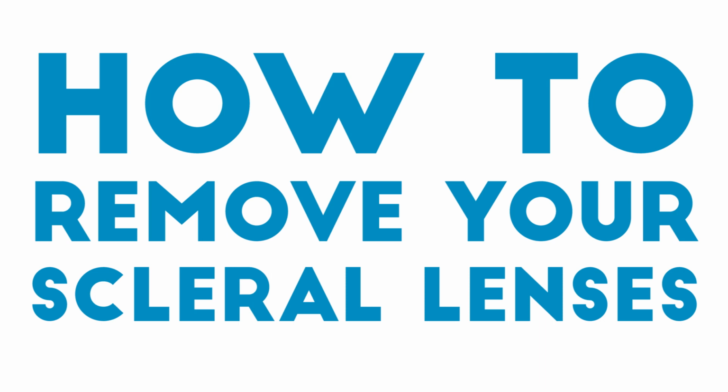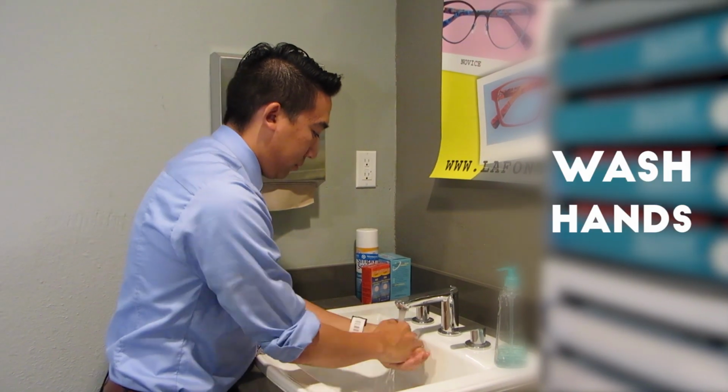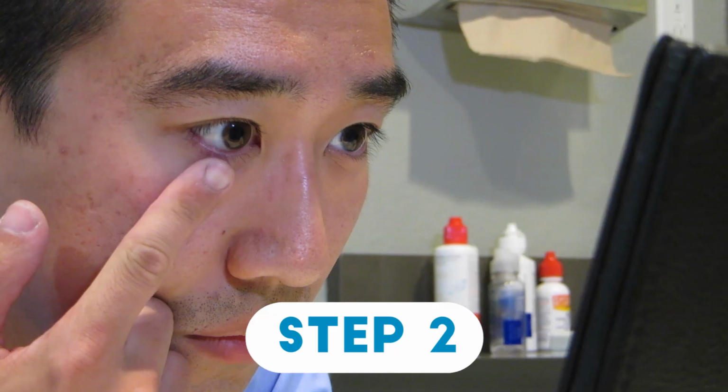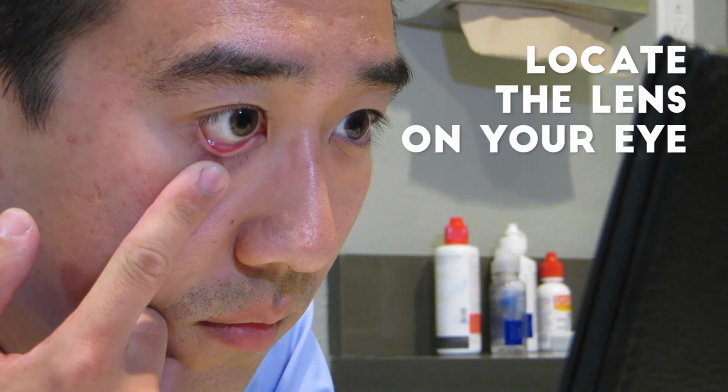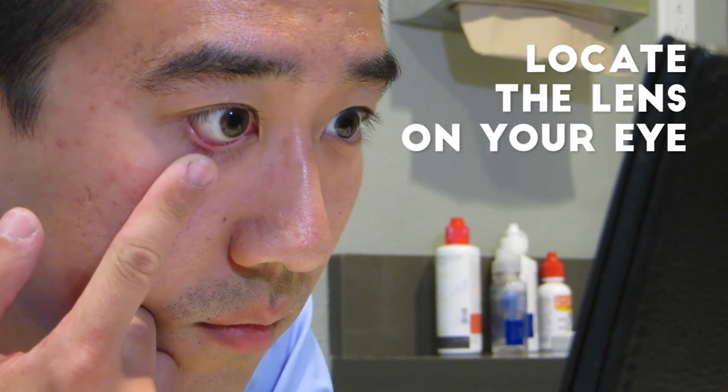How to remove your scleral lenses. Step 1. Wash your hands again with lotion-free soap and a lint-free towel. Step 2. Look into the mirror to locate the lens on your eye. Always be sure that the lens is on the eye before attempting to remove it.